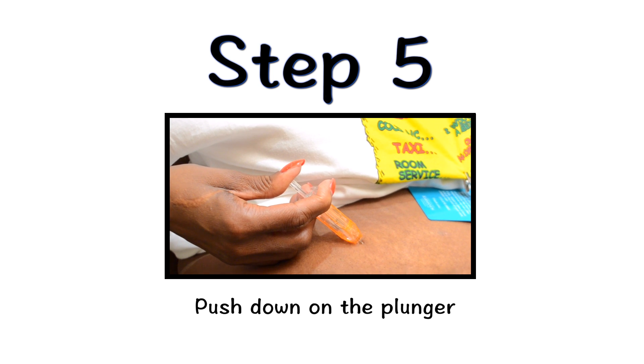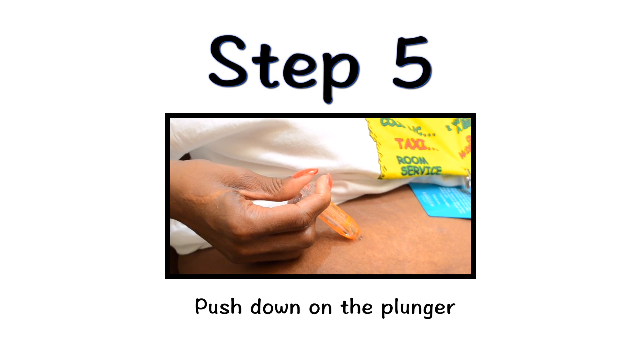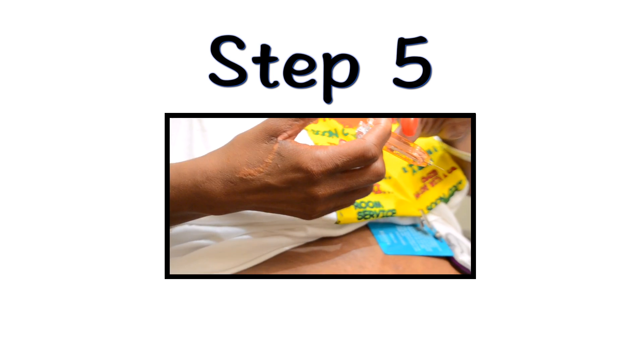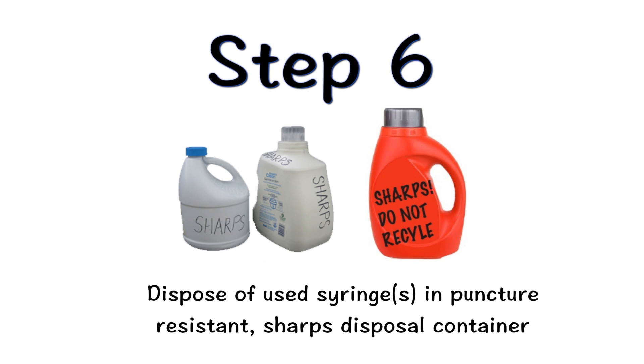Use your finger to gently push down on the plunger. When the plunger head is as far down as it will go and all of the Neupogen has been injected, remove the needle from your skin. Be sure to activate the safety device before disposing of your syringe. Dispose of used syringes in a puncture-resistant sharps disposal container immediately after use.